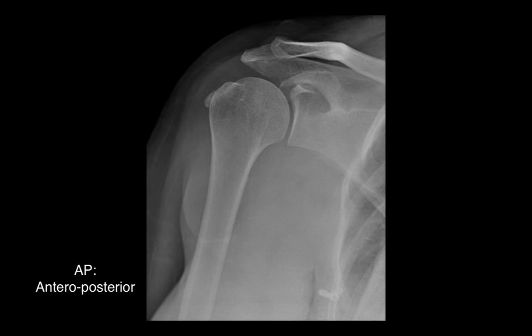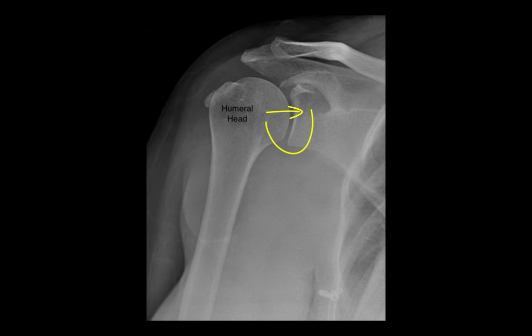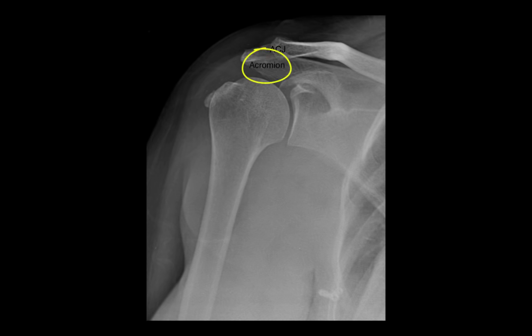This is an AP view of a shoulder, and we can see here the humeral head articulating with the glenoid fossa of the scapula. The glenohumeral joint isn't the only joint of the shoulder, and it's important to specify that you're not talking about the acromioclavicular joint, which is formed by the acromion process articulating with the distal clavicle.